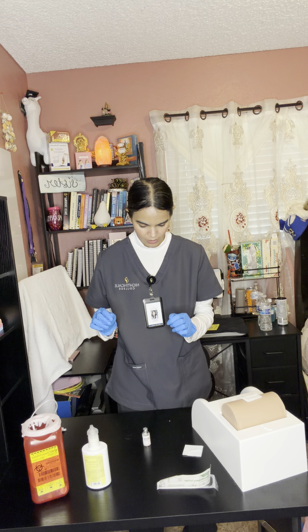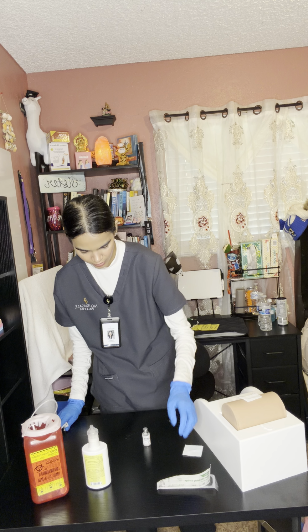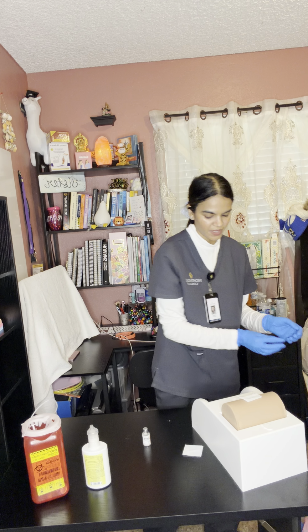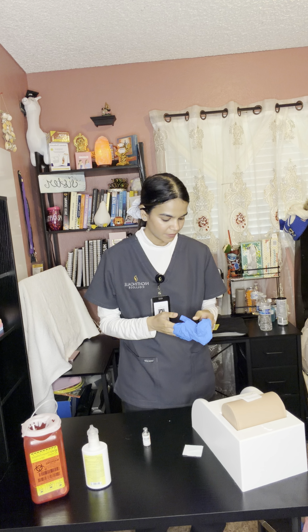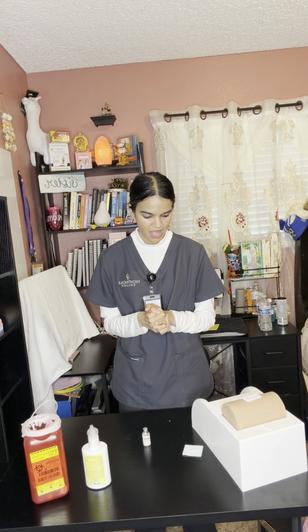I will now clean up the area and remove my gloves. I will ask the patient if they are experiencing any side effects and check the site. I will then document the procedure that was performed and any findings that I may have found, as well as the condition of the patient and how they tolerated the injection.